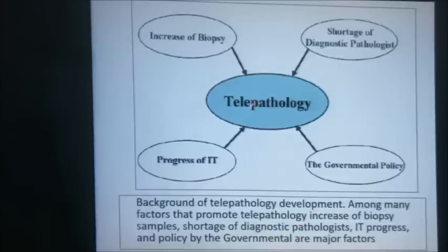This is telepathology. The urge to use telepathology is due to the increase in the number of biopsies. There is a shortage of diagnostic pathologists. Here in the UK, as I said before, only 3% of the hospitals have enough pathologists, okay? So we need those who are retired to work. We need those who can work out of hours, so they can use telepathology.